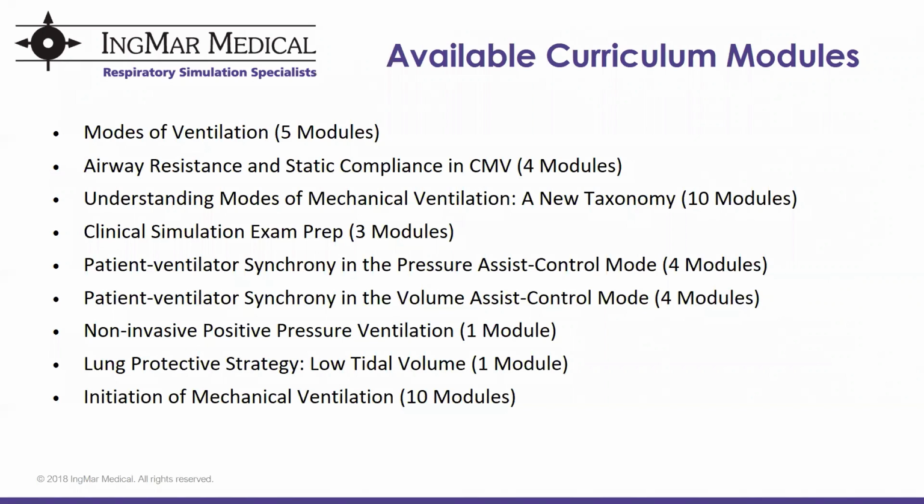Though we do use a number of research studies to inform the parameters that are pre-programmed for our scenarios, we do ensure that all aspects of the scenarios, from breath parameters to vital signs and x-rays, are fully editable by our users. This way, you can tailor the scenarios we've created to meet the needs of your curriculum.